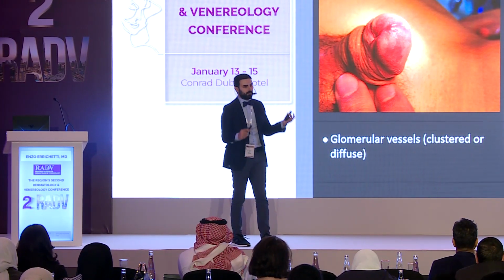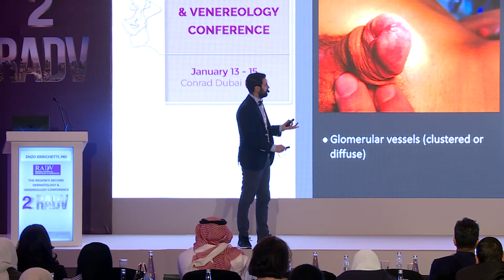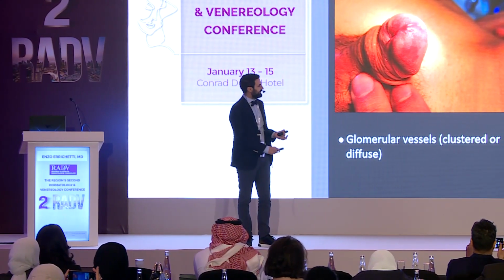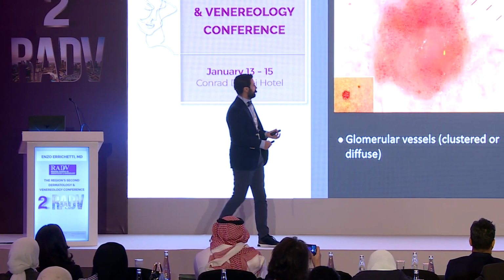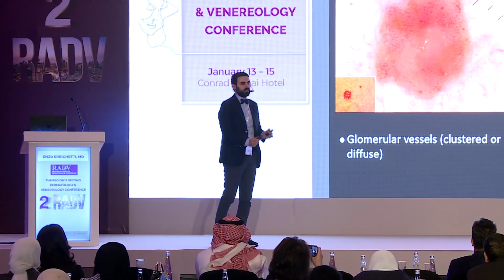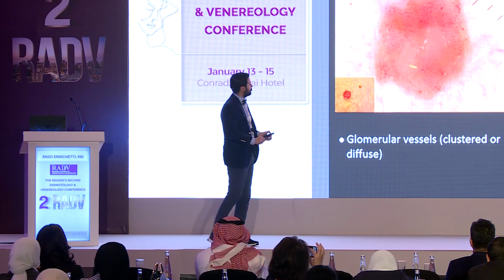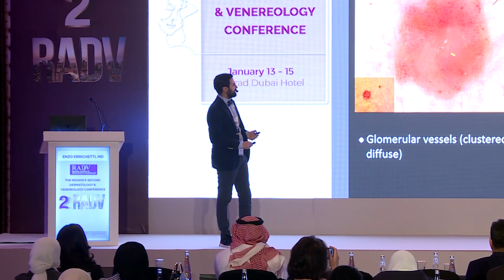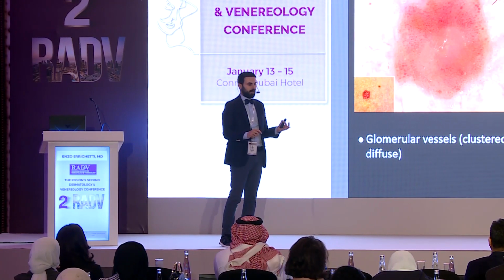And then we have erythroplasia of Queyrat. What do we have here? Here we have glomerular vessels. This pattern is similar to Bowen's disease, which is the cutaneous counterpart. Here, what do we have? We have these glomerular vessels arranged in a clustered pattern, okay?